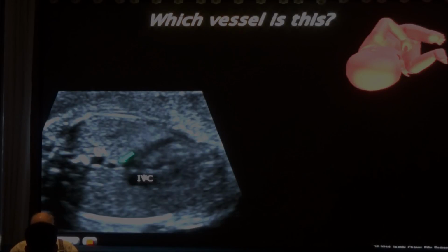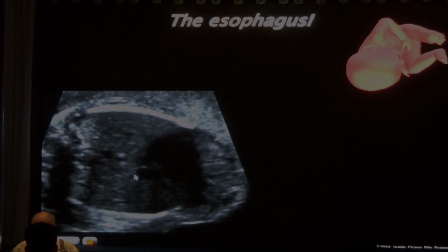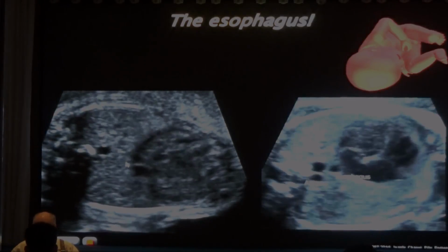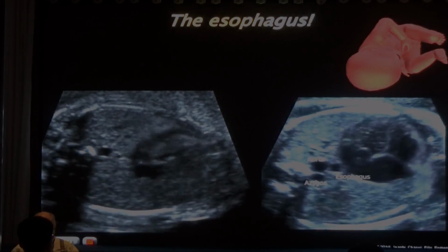And so I'm making this appear. What was that? Photoshop? Not Photoshop. This is the esophagus. Baby swallows fluid, and you see the fluid go through the esophagus. That's a normal finding. Another one here, aorta, esophagus, azygos.